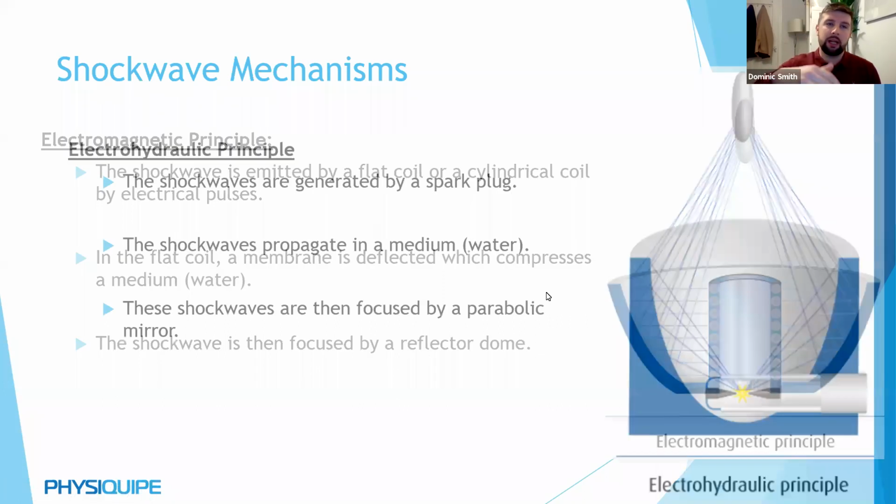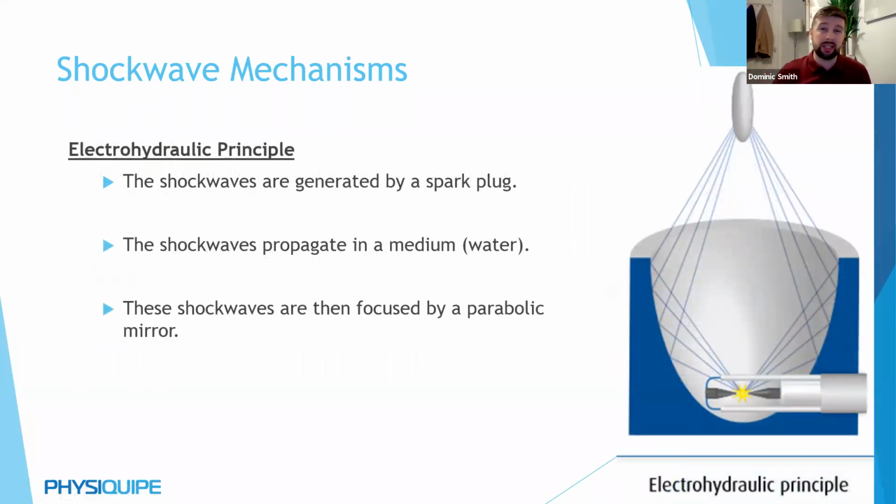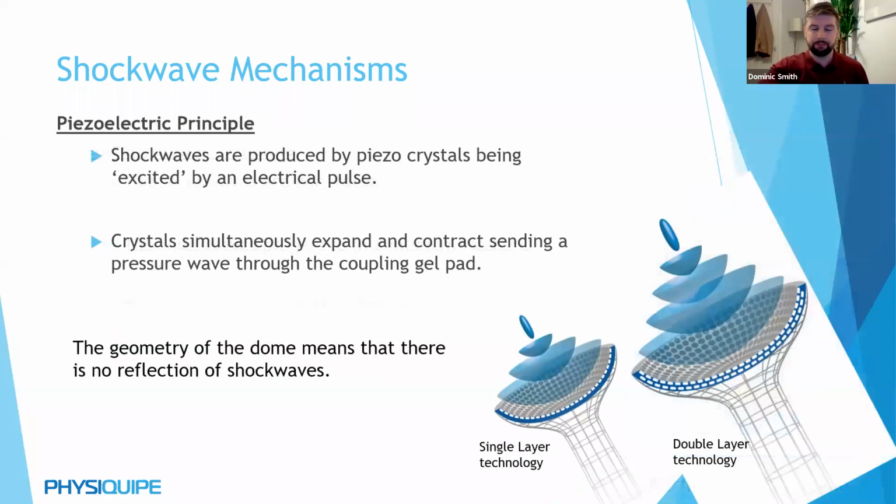And then you also have electrohydraulic. This is generated instead by a spark plug rather than that magnetic coil. Again, these propagate through water, hit what we call a parabolic mirror, which then again bounces into that focal point to create your shockwave. Those two are what we call indirect focused shockwave. The reason it's indirect is because we're bouncing it to create that shockwave focal zone.